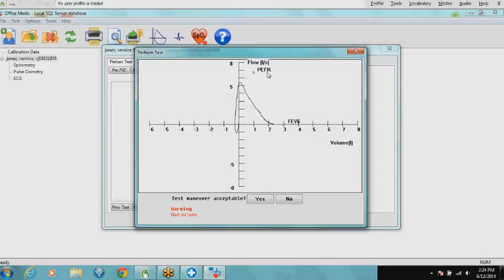Now, let me talk about these two markers here. PEFR, your peak expiratory flow rate based on your demographics: you should be getting your graph closer to that if you don't have some type of condition. And you should be able to blow out to your FEV6 value, so you should still be able to maintain blowing out up to that 6 seconds. That doesn't mean that you shouldn't be blowing out as hard as you can, as fast as you can, but you also need to be blowing out as long as you can.